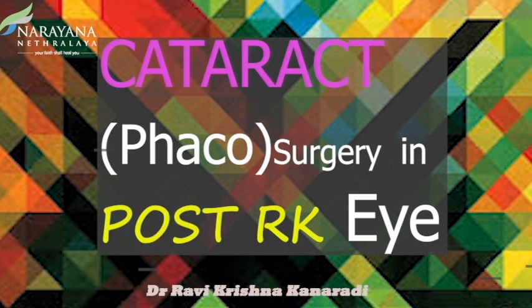We present one of the most challenging cases, cataract surgery in eyes that have undergone a prior radial keratotomy. Patients who had undergone the RK surgery in the 80s and 90s are now developing a visually significant cataract. The main challenges here pertain to the perioperative planning, surgical execution, and the refractive expectations.